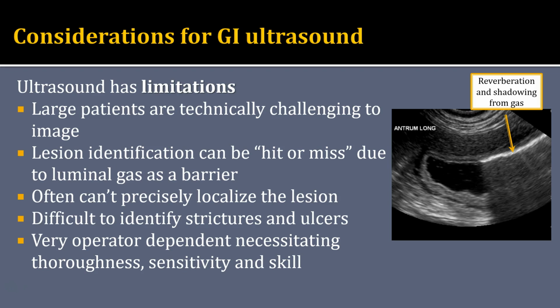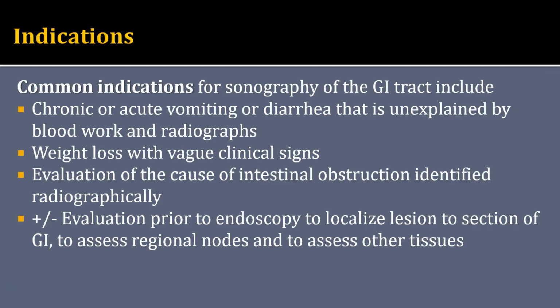We have to be highly skilled, we have to be highly sensitive to identifying abnormalities, and we have to be very thorough. Sometimes we want to consider actually doing an upper GI series to know that we've evaluated the entirety of the GI tract and haven't missed anything. And we should keep in mind that not finding a lesion does not infer its absence.